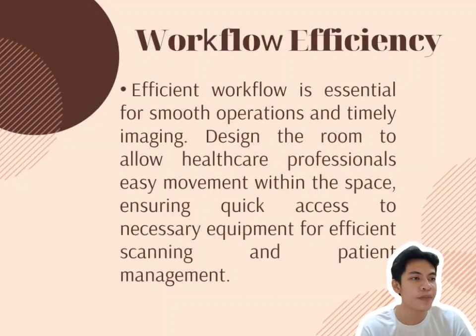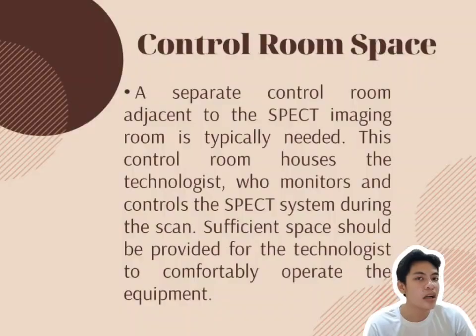Workflow efficiency. Efficient workflow is essential for smooth operation and timely imaging. Design the room to allow healthcare professionals easy movement within the space, ensuring quick access to necessary equipment for efficient scanning and patient management. Control room space. A separate control room adjacent to the SPECT imaging room is typically needed. This control room houses the technologist who monitors and controls the SPECT system during the scan.